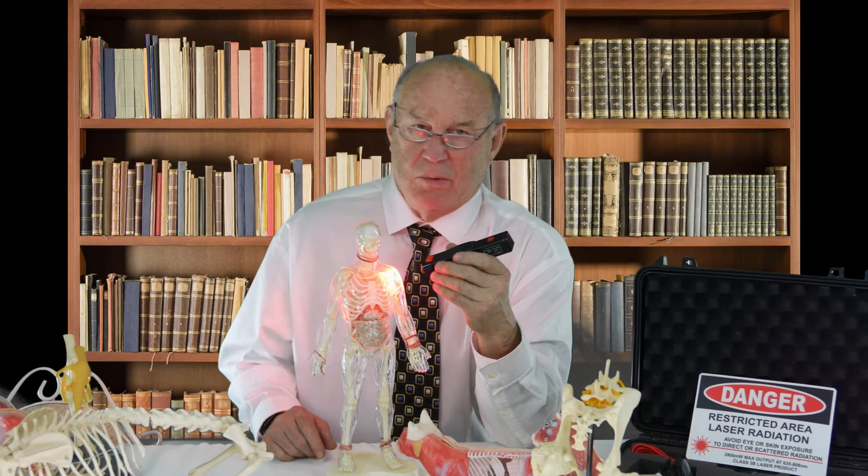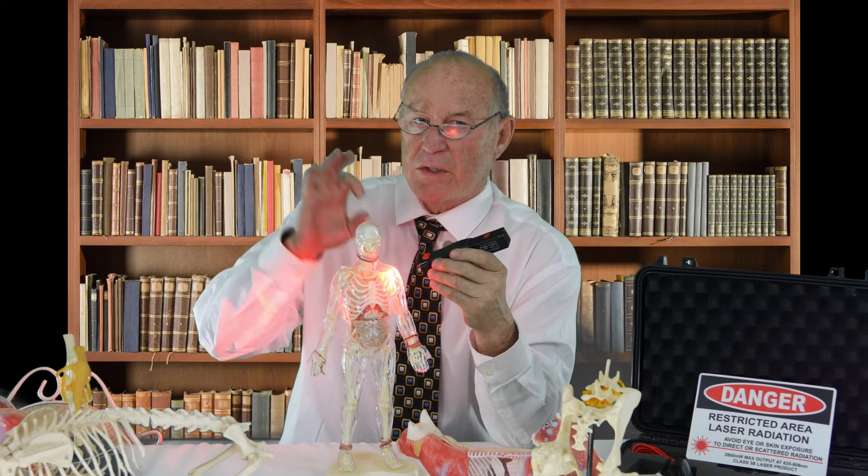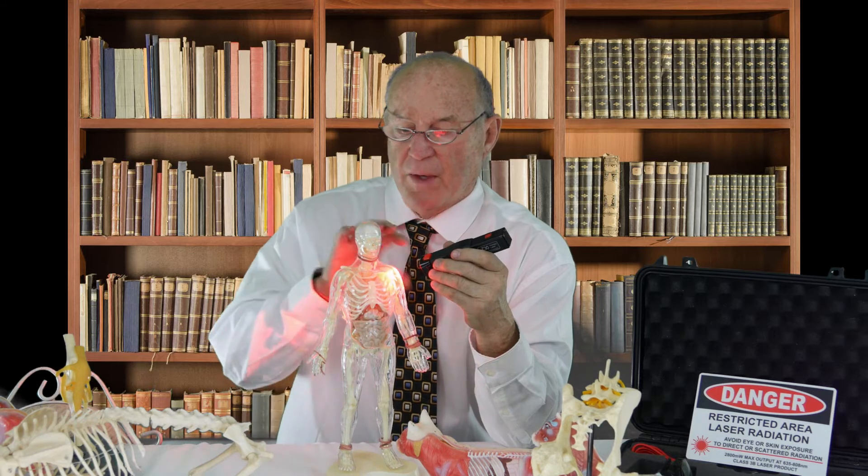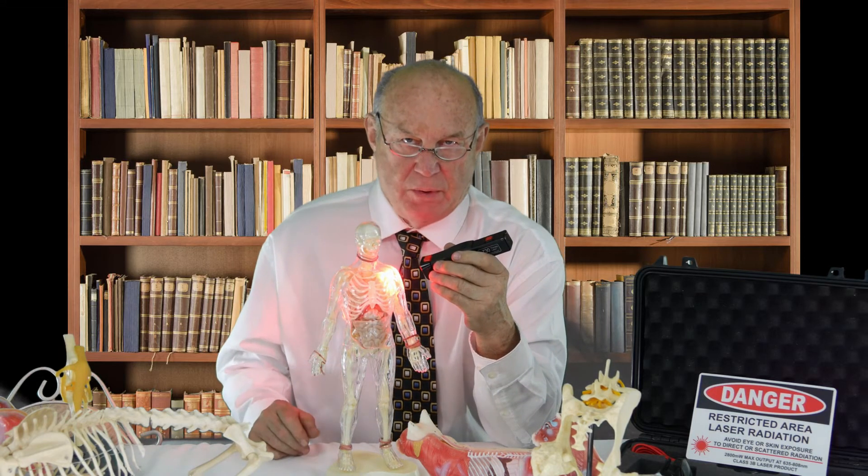We want you to use that protocol. You might say it's not a fracture — obviously — but the frequencies in the fracture nonunion protocol are very beneficial for chronic joint problems.